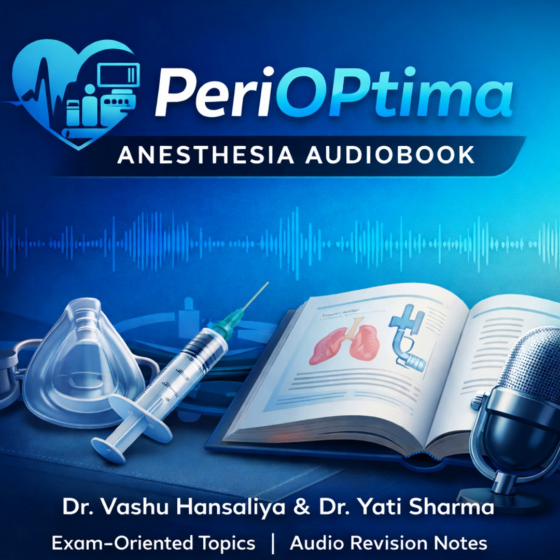And when you turn it back on? You will shower that clot into the brain, the kidneys, the legs. It's a thrombotic catastrophe. Rule: never leave an IABP static in the patient for more than a few minutes. If you have to pause it for transport or something, you must flutter it manually every few minutes to keep it clean. Got it. Okay, that covers the IABP in good detail.